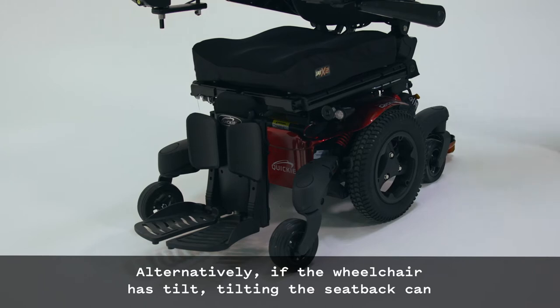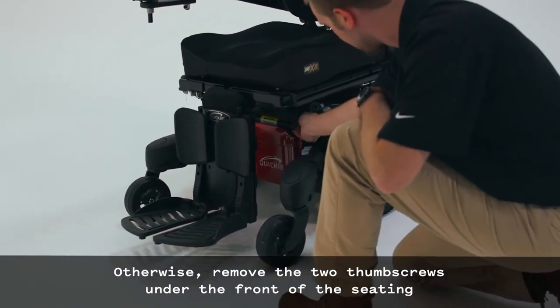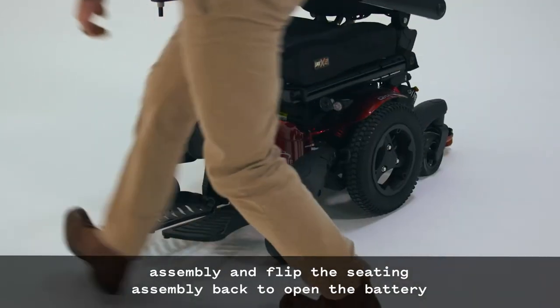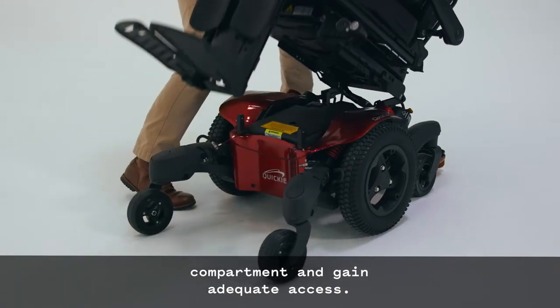Alternatively, if the wheelchair has tilt, tilting the seat back can also provide adequate room to work. Otherwise, remove the two thumb screws under the front of the seating assembly and flip the seating assembly back to open the battery compartment and gain adequate access.